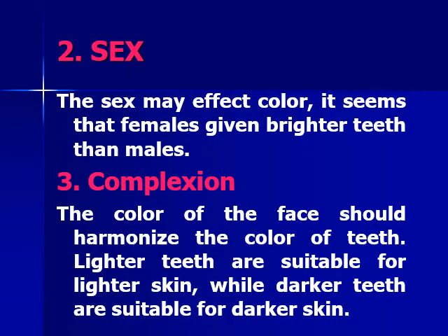Sex may affect the color. It seems that females have brighter teeth than males. For the complexion, it means that the color of the skin of the face should be harmonious with the color of the teeth. For example, lighter teeth are suitable for lighter skin, while darker teeth are suitable for darker skin.